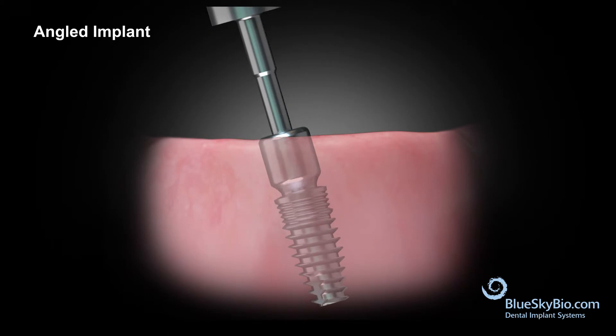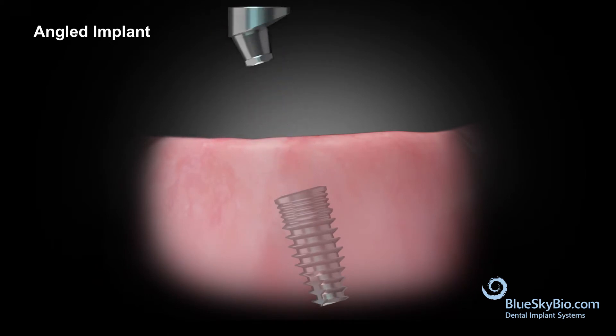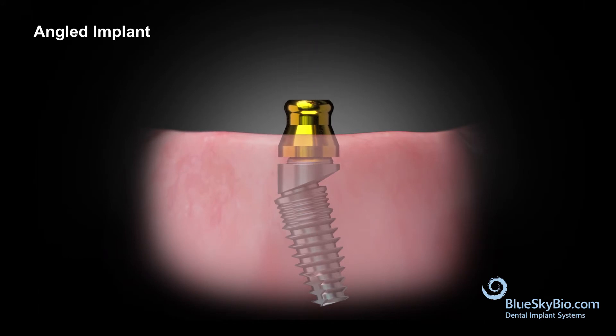Remove the healing abutment on the angled implant. Orient the multi-unit abutment so that the top platform comes into parallel with the other implants, then torque to 30 newton centimeters. Use the hex driver to place the male over denture component onto the top of the multi-unit abutment and torque it to 15 newton centimeters.